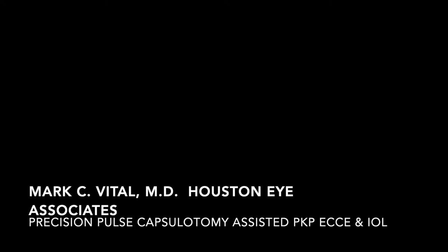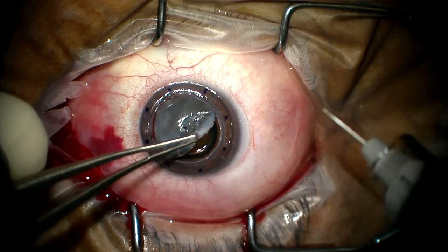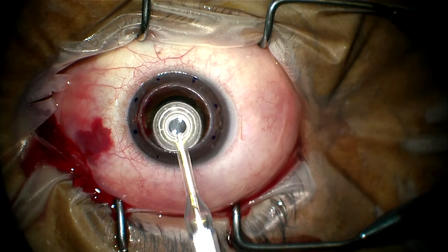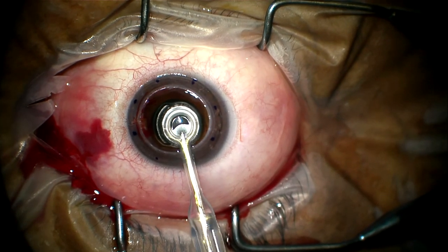This is a case of a failed PKP for keratoconus with a cataract. The cornea is removed, the precision pulse capsulotomy handpiece is applied with suction, energy is engaged, and the handpiece removed.